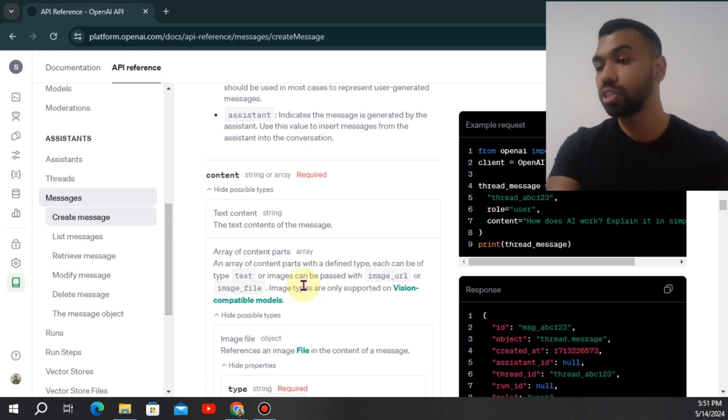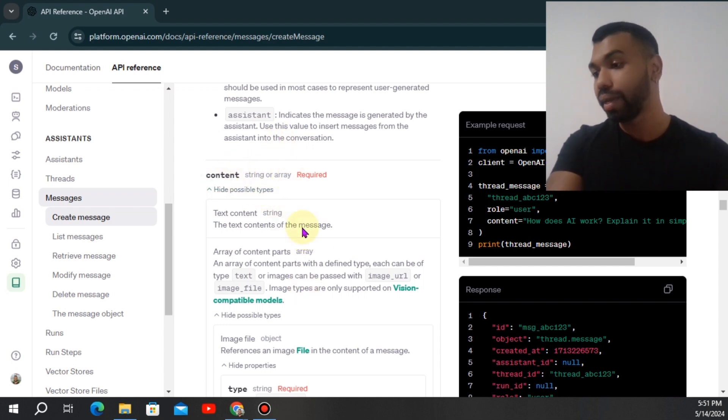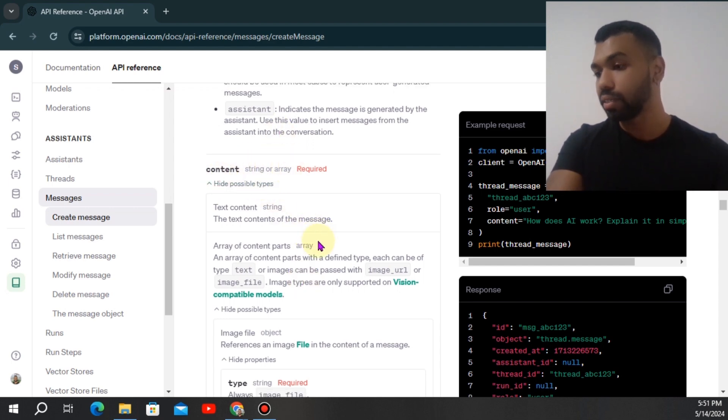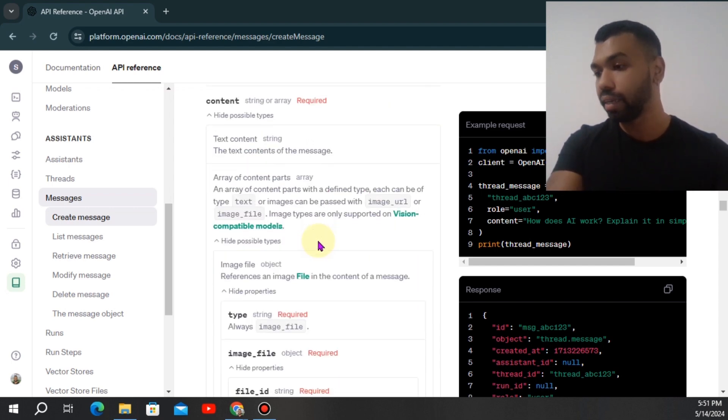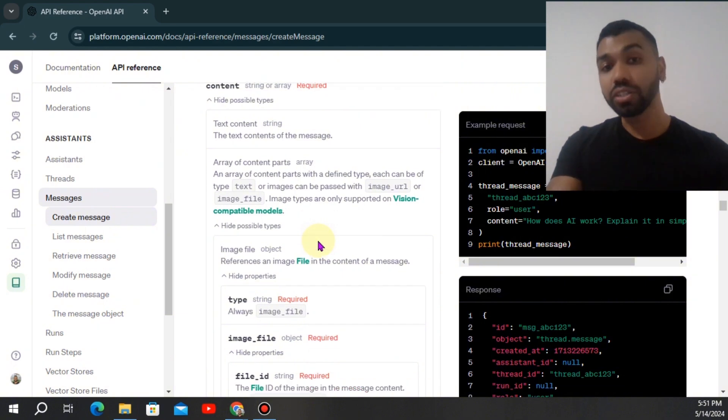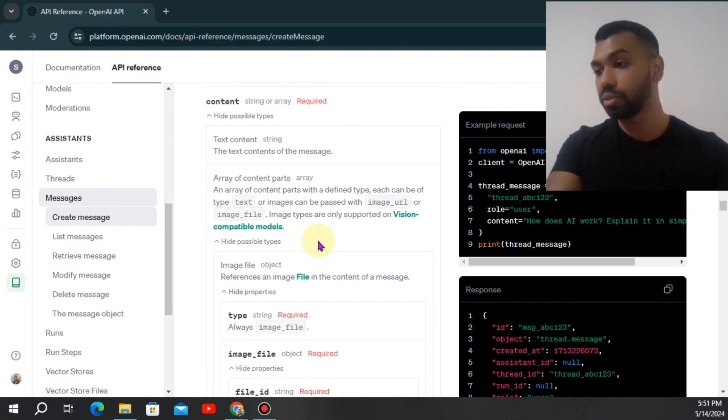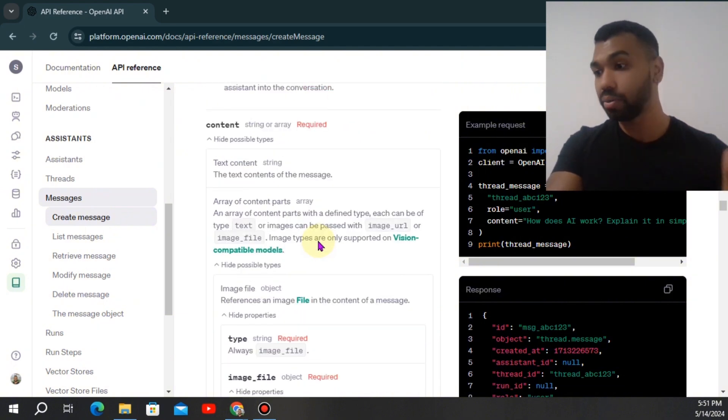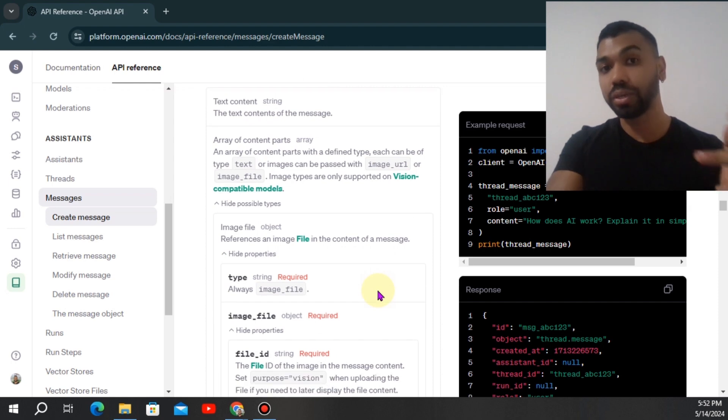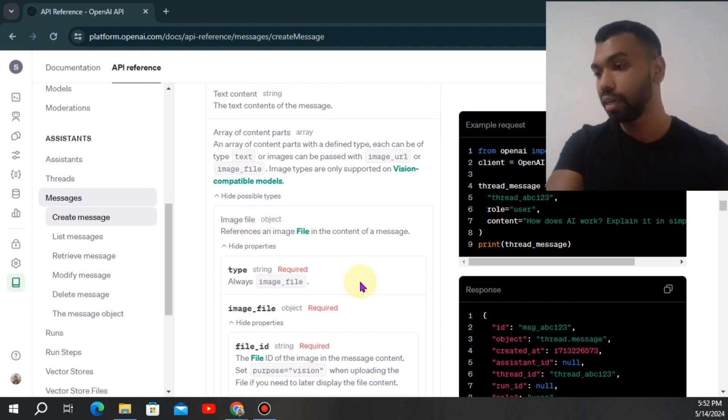Now when you're sending off an image to the assistant, you want to set the role as the user and the content will be image. We also want to send text, so we're going to send this off as a list. It's going to contain not only the text content, but it's also going to contain the image file object.